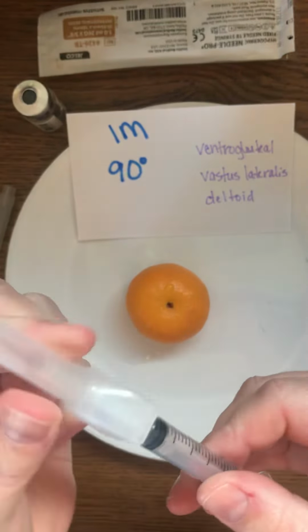All right, so again, we always want to keep the caps on our needles for as long as possible because we don't want to accidentally contaminate the needle. So we're going to stick with our 1 ml injection. I'm going to pull up my 1 milliliter of air. And then again, I'm going to have a clean alcohol wipe, and I'm going to clean that, and I'm going to clean the person's skin.